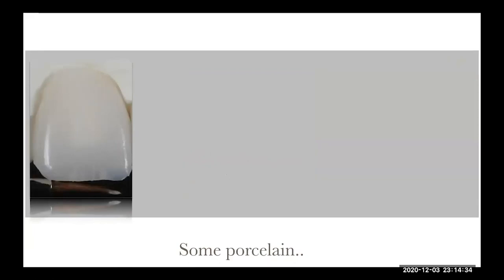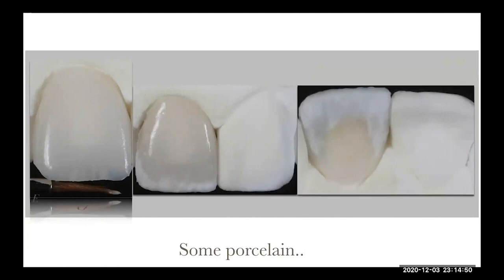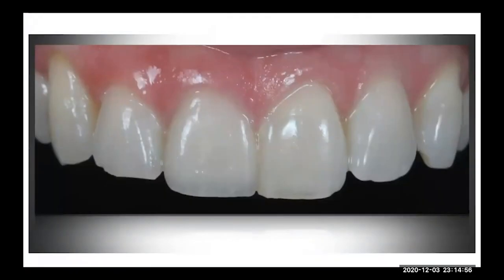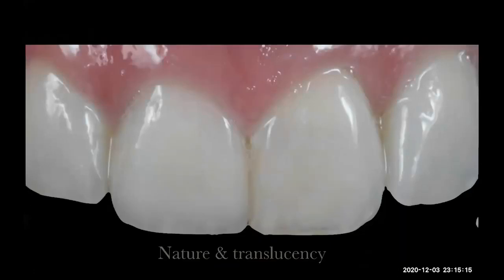So for the tooth that I need to mimic, I use this kind of effects, you know, some cream, some blue, some white, and then I bake it, and I did all my stratification with Opal 1 from IPS e.max Ceram, okay? And this is the try-in. Remember, this was my first case using a scoop technique. Okay. So this is a month control. We did the value picture, and this is our final result.